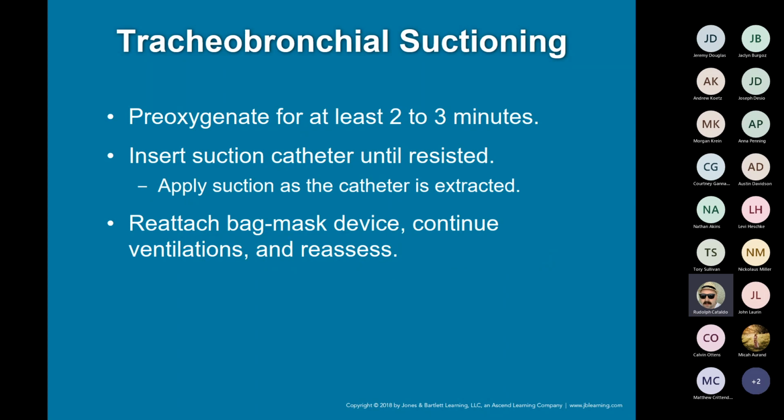Remember that you are sucking oxygen out of somebody. You're sucking air out of their lungs. So pre-oxygenating, sure, but if the suction is detrimental to your patient's health, like you need to perform it now, you don't have time to do this or that, then that's what you have to do.